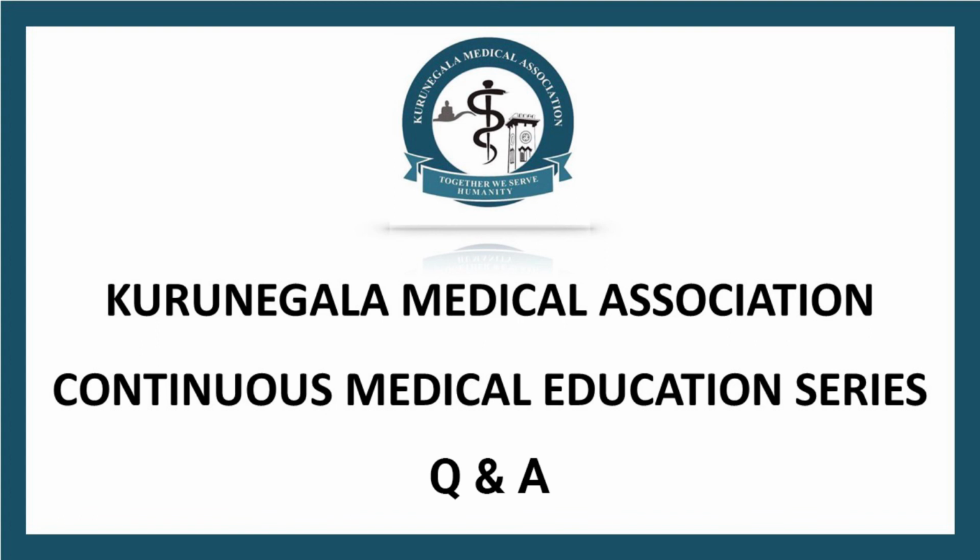Prerequisites to give CPAP are a conscious patient who is cooperative, capable of maintaining the airway on his own, and able to protect the airway. Anybody with these criteria can be given CPAP if indicated.